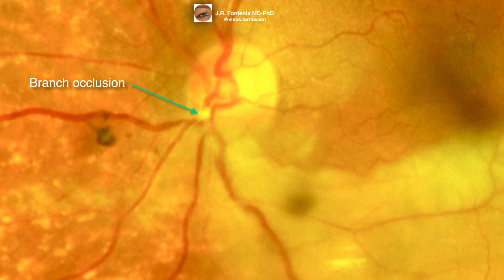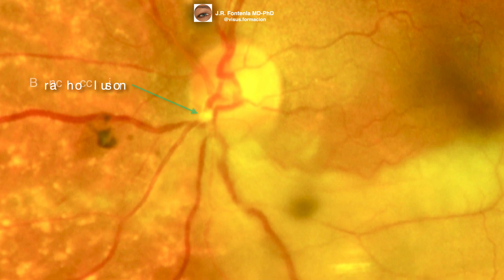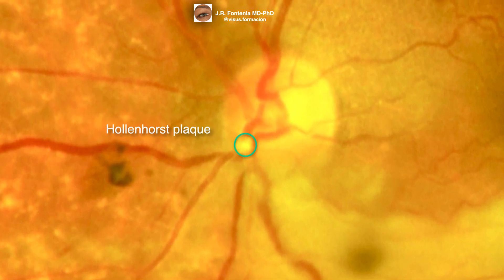In this case, the arterial occlusion has occurred in the inferior temporal branch just before reaching the edge of the optic disc. With some difficulty due to edema, the embolus — the cause of the arterial obstruction, a Hollenhorst plaque — can be seen.